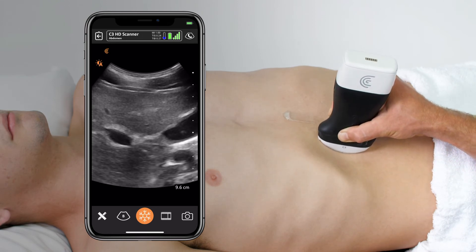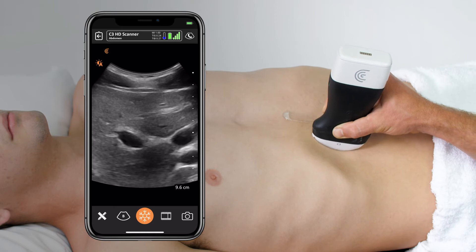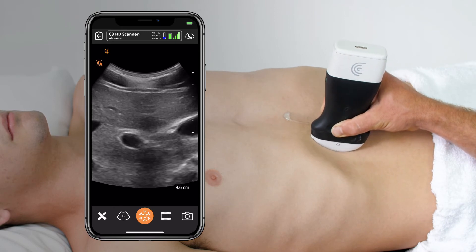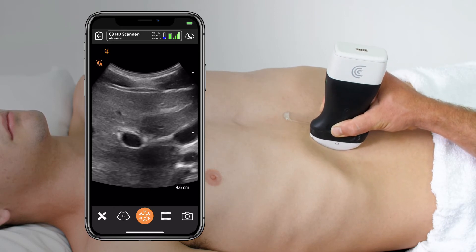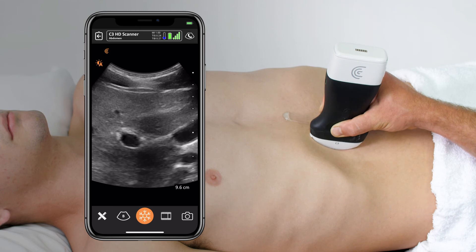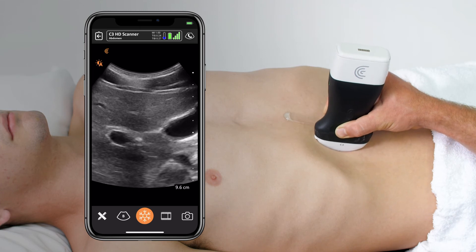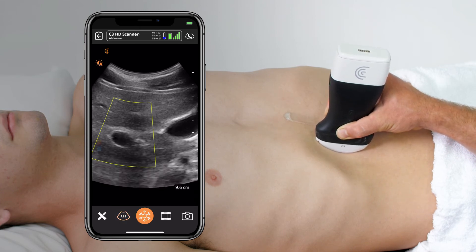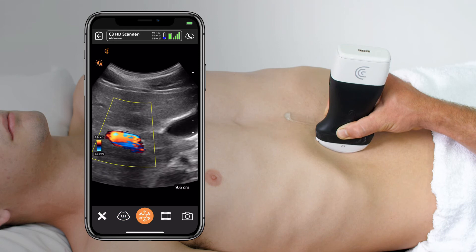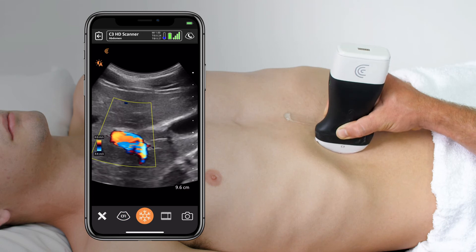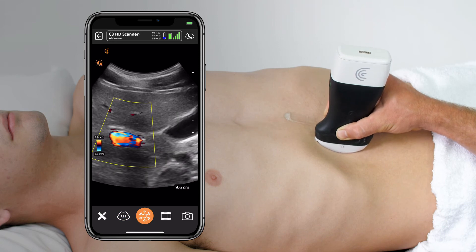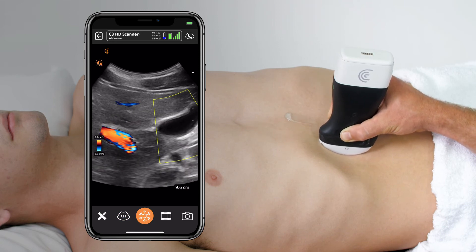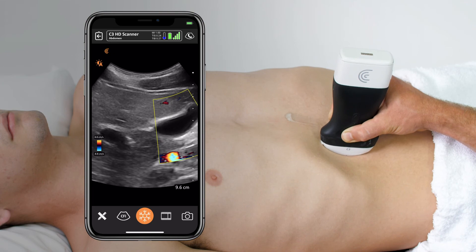Once I've swept through there, I look again at the portal vein and make sure I don't see a second dilatation suggestive of choledocholithiasis. And if at any point I get confused, I can put on color mode to identify what's clearly a vascular structure here as the portal vein, and showing that the gallbladder is clearly not.